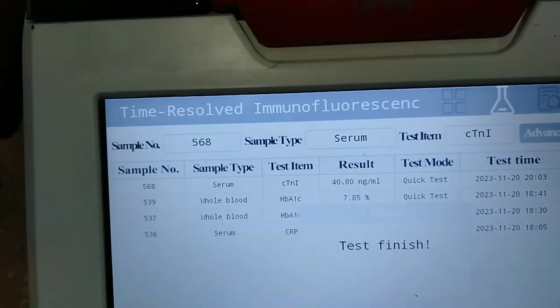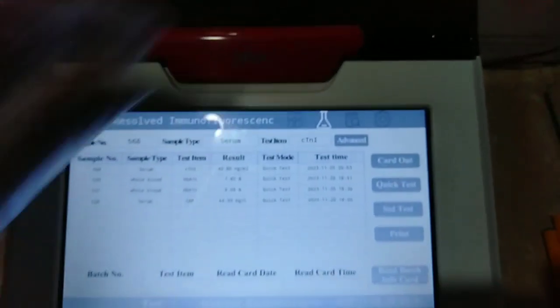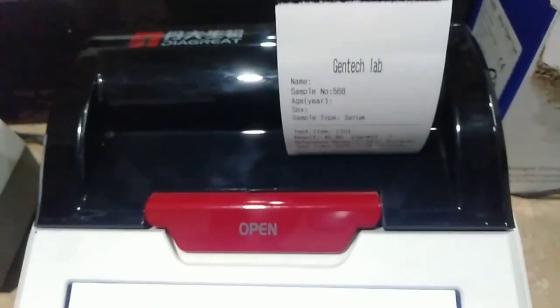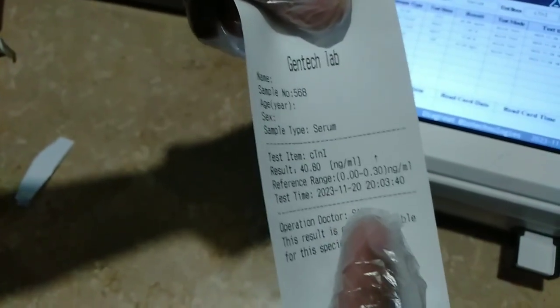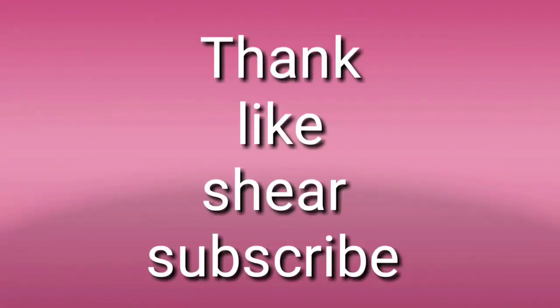After a few seconds we will get the result, and then we will click on Print — this will give a printed page, as you can see. Now we will take it — this is the range. We got 40, which means it is an abnormal result. The normal range is mostly 0 to 0.3. So this is all about the troponin test. Thank you so much for watching.